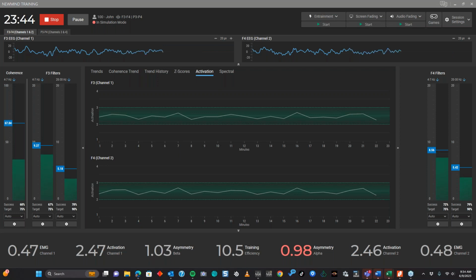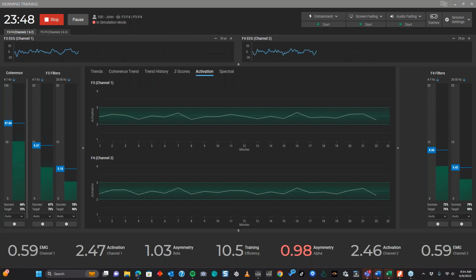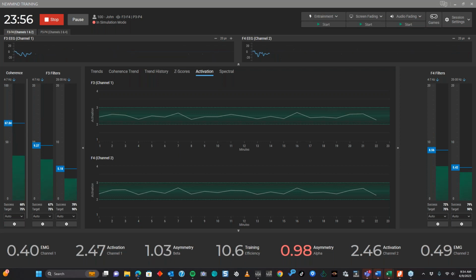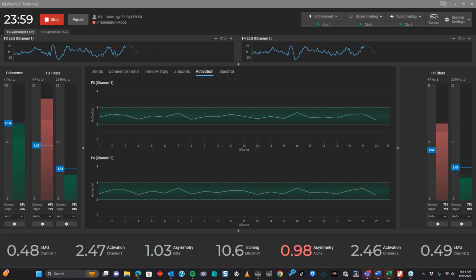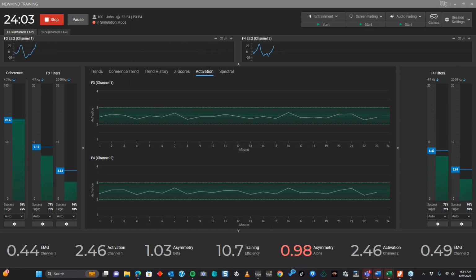So sometimes we may need to look at other resources to determine if you're getting really excessively high activation scores or artifact, to see what's going on. And it could just be that it's that person's posture, and they sit still and you're scratching your head and you just can't figure it out. So just another thing to think about. Yeah, it's a good thing you brought that up.